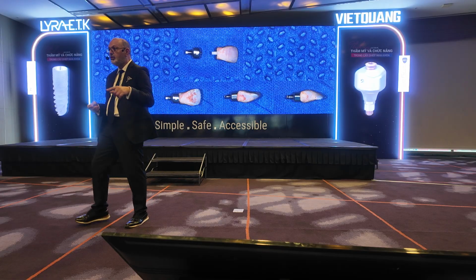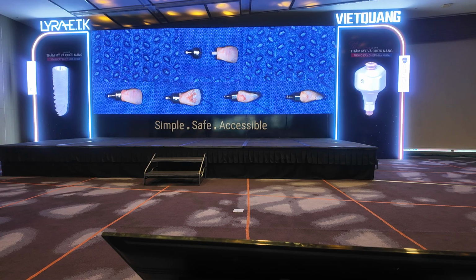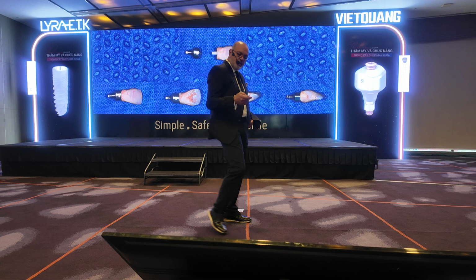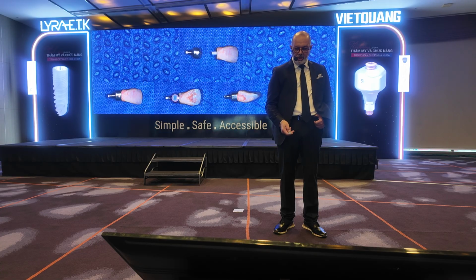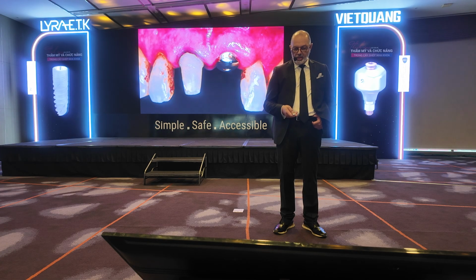For sure it's not the one we will use, because the one we will use is not to be touched. Okay, we take an old one in order to set our provisional and to polish this part as well as we can. So this is the provisional, or the natural tooth used as a provisional.